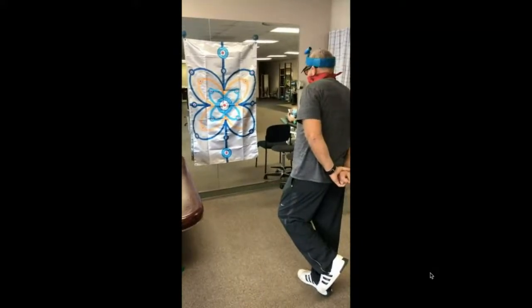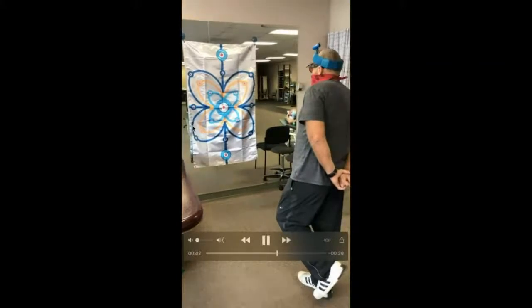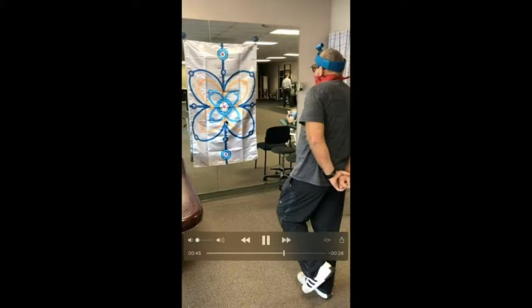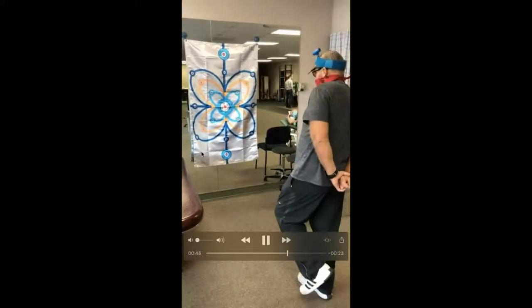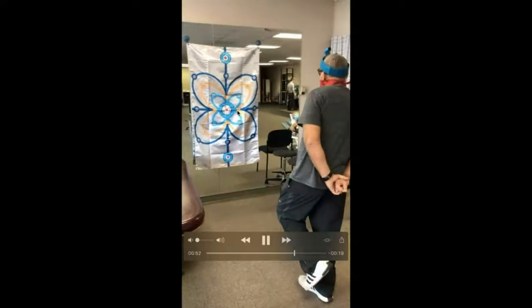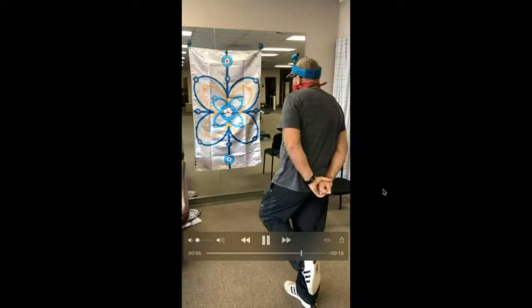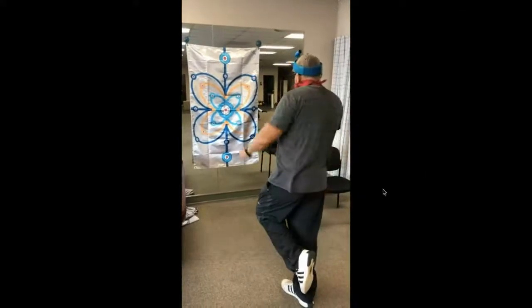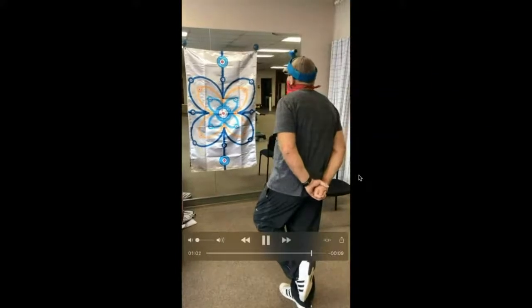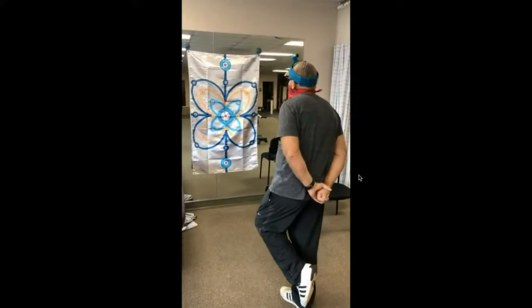Now, if you watch what happens when he's to the left, he really changes his control pattern. He freezes a little bit. He can't get back to the center. This one is nice and precise, and this one is still tough down there for him. If we compare that to the other side, which I think he'll go through next, he got better there on that third one. As he starts to go through the other axis, down to the right and up to the left, much more comfortable for him to do that.